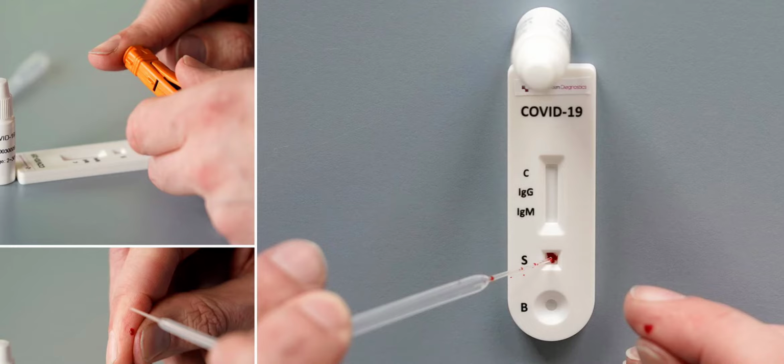First of all, we have to know what labels are provided on the device. On it you can find B, S, IgM, IgG and C. Actually there are 5 labels. First, B is the port where we load a buffer solution, which is used to elute the blood sample from the initial stage to the end. C is the end point of this test. For that, the buffer B port is useful.